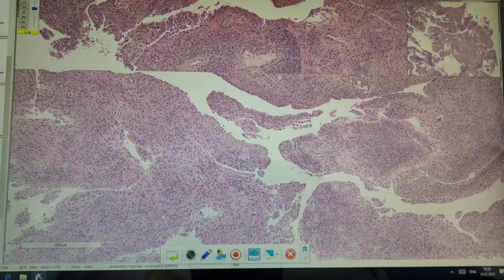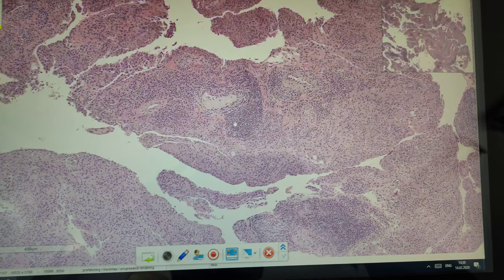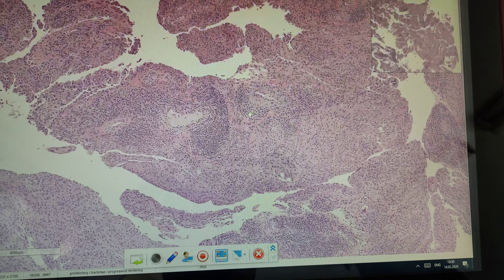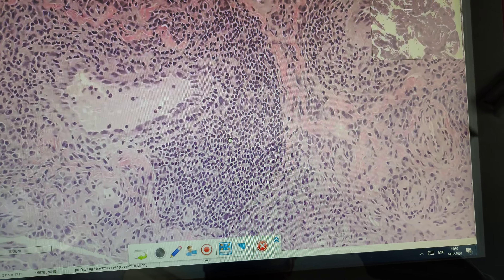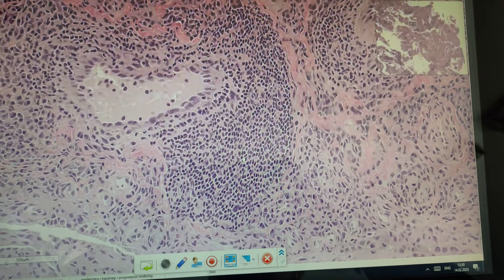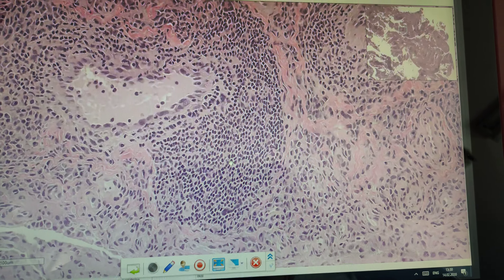Infiltrates are, for example, here. The infiltrates are also non-specific. The cellular composition you already remember: lymphocytes, plasma cells, and macrophages.